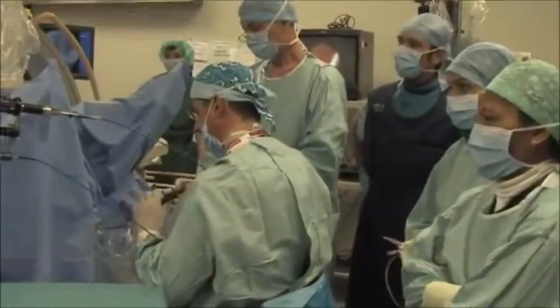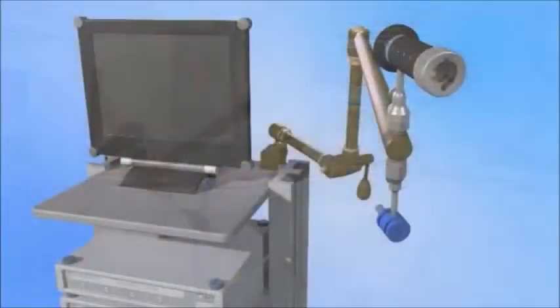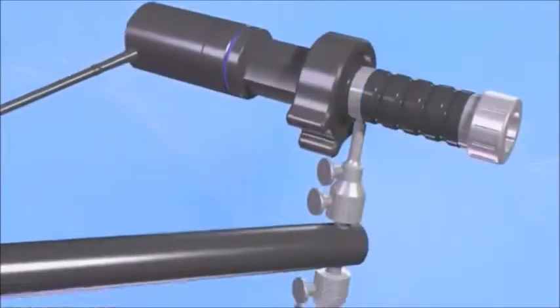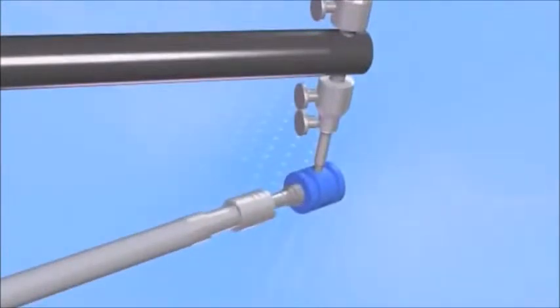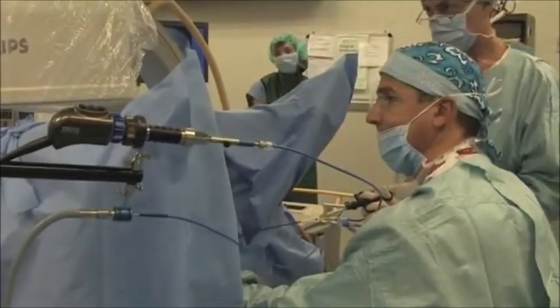The Poliscope system adapts to all current video towers. The use of the Poliscope is facilitated by the three joint utility arm, which holds the Poliscope eyepiece as well as the light adapter. The camera head and the light cable are connected to the system and kept outside the sterile field, eliminating the need to sterilize these components between cases.